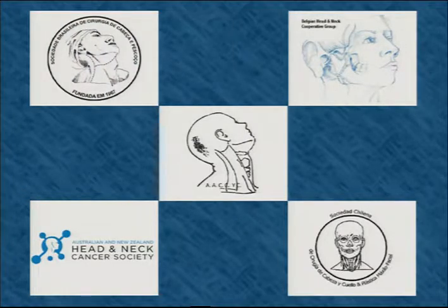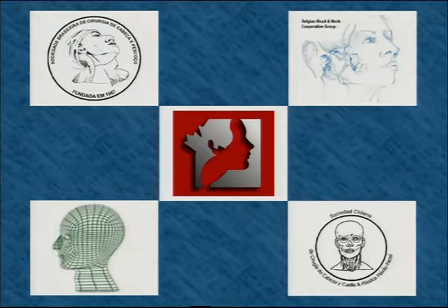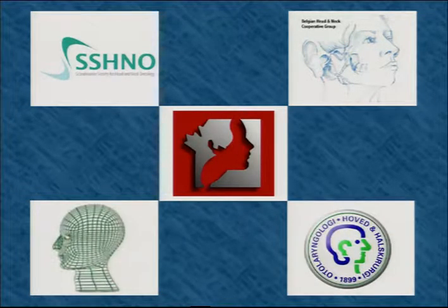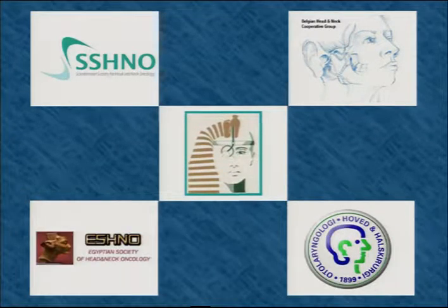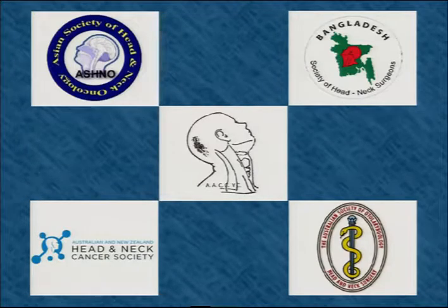And so on the other side, I would be more conservative and do what we call a near total thyroidectomy, where we isolate a little bit of thyroid tissue by the ligament of Berry where it's attached to the superior parathyroid gland, and take my advanced energy device and cut through the thyroid tissue, leaving only behind a couple of 3 millimeters of normal thyroid tissue with that parathyroid gland.